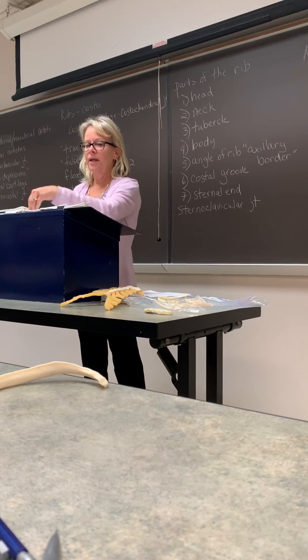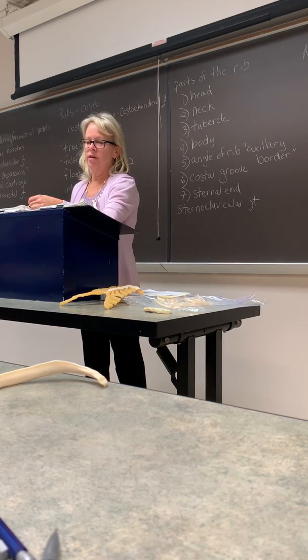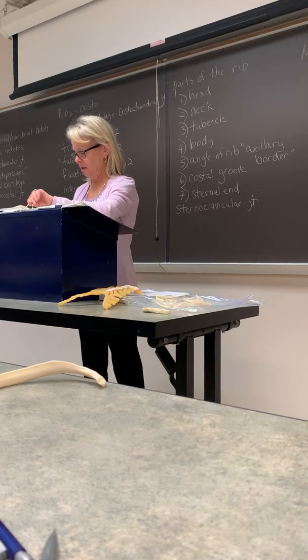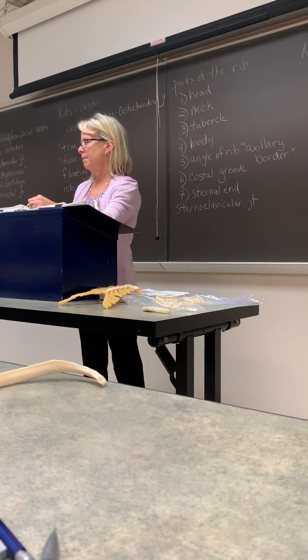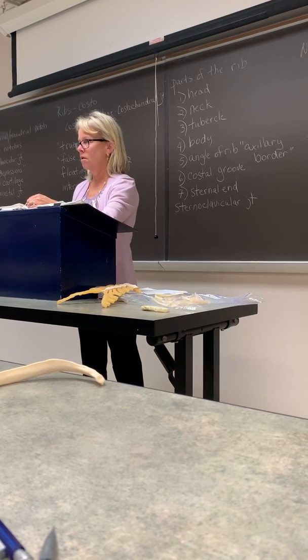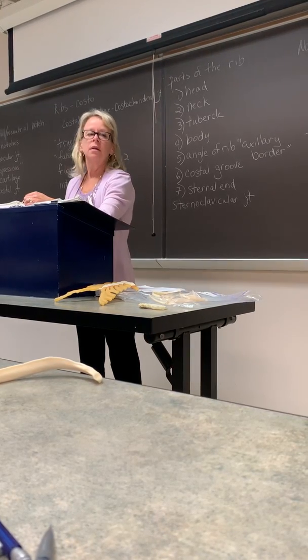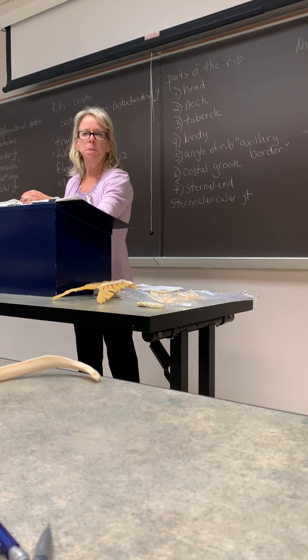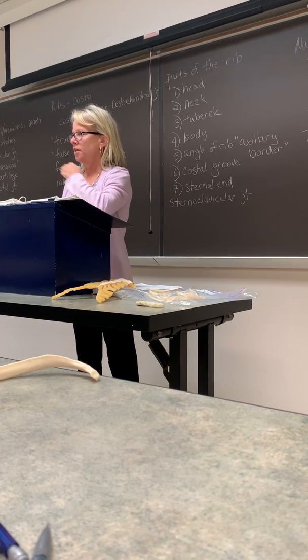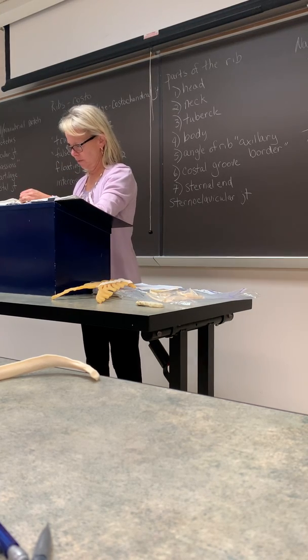All right. Anterior rib injuries, if it's occurring in the anterior aspect, if possible, do them PA. Why? Reduce the dose. Good. Puts the anterior ribs closer to the image receptor. That's what you want to see.